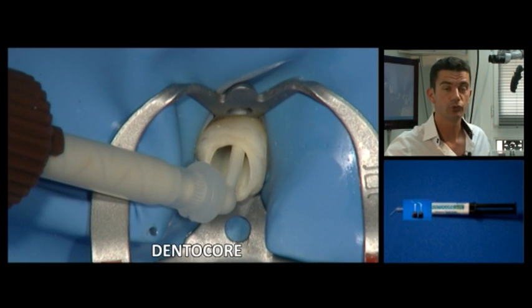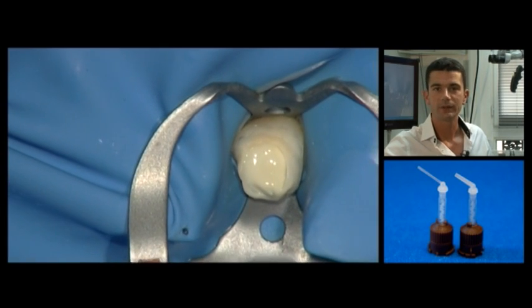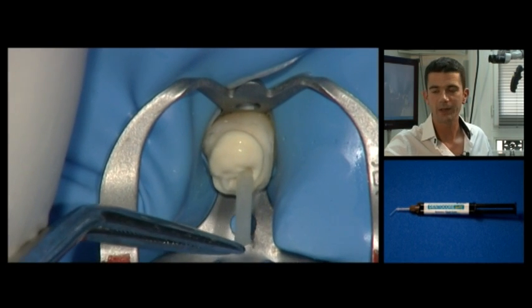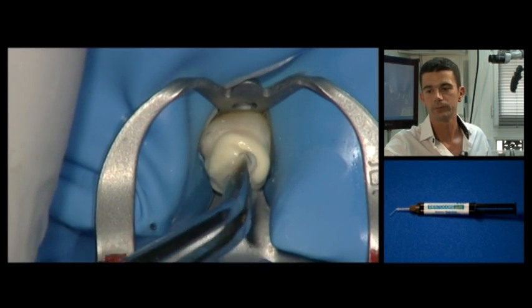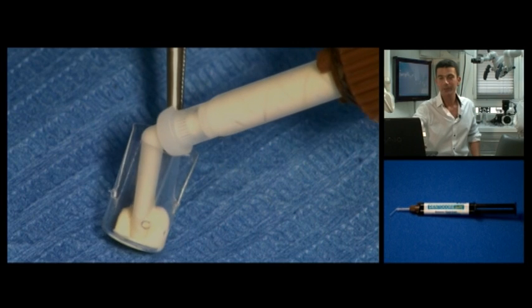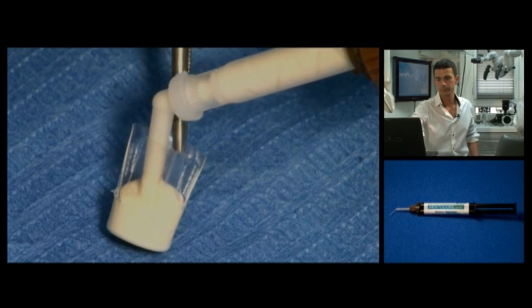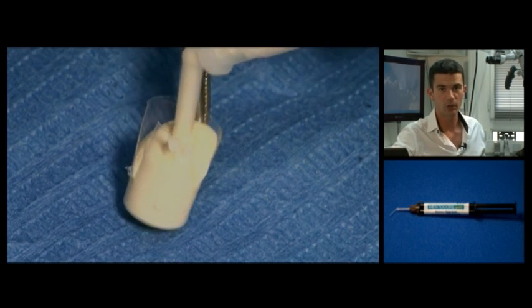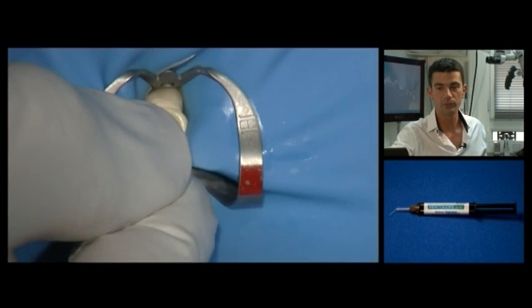The restoration composite is injected using an auto-mix syringe with a tip suitable for ensuring a deep seat and no bubbles anywhere in the canal. The post is then immediately put in place against the gutta-percha, and its positioning must be checked before the material sets. The composite should be injected right into the base of the matrix to prevent any bubbles forming. The matrix must be completely filled to ensure there is no deficiency. The matrix is placed in the mouth and the operation is completed.